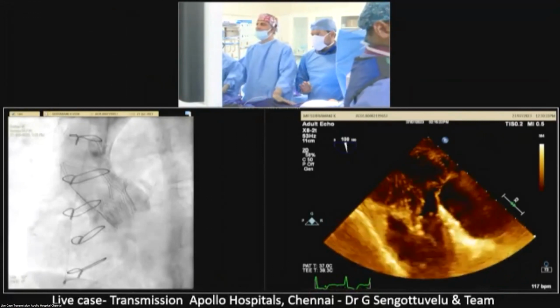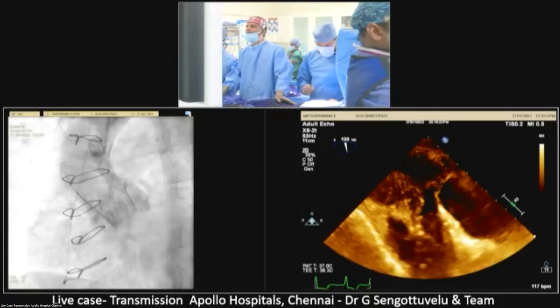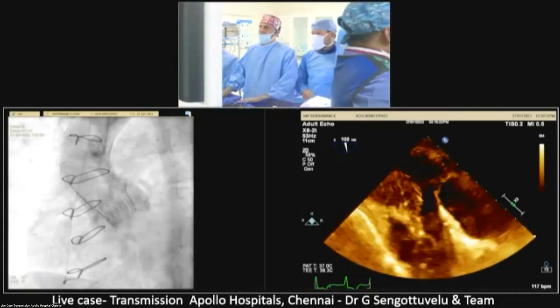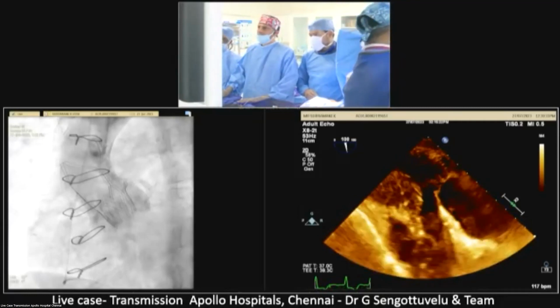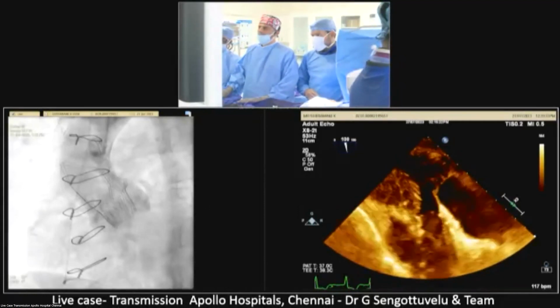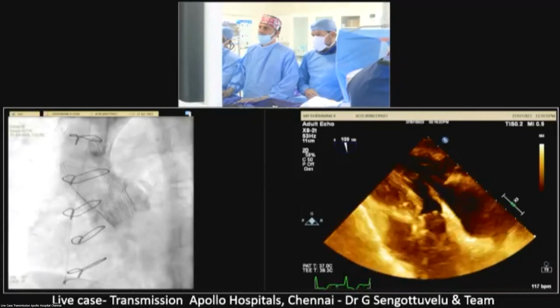I do think you highlighted an important point. The patient was stable, and you went through the thought process and made the right decision. You put the TEE probe down and did a complete assessment. That highlights some of the things you have to go through in the thought process. Rather than going straight and saying, well, I have to put this, really assess what the result is, what the goals are, what will happen with another valve, and where it is going to sit. You'll be below the leaflets of the other valve. The LVOT will push it up as well. So it's not trivial to do that.